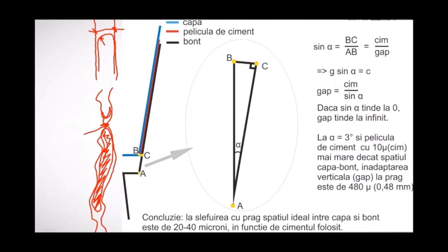You can try to press it. You need the force of the impact between two planets. It's impossible. The patient is not able to give this, no matter how much you tell the patient, bite down. Come on, that's crazy. Okay, our cement is a fluid, that's true. But this fluid has a minimum thickness, and in blue is the coping, the metal coping or zirconia, whatever it is, the crown.